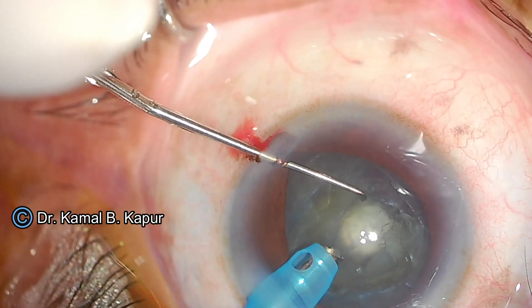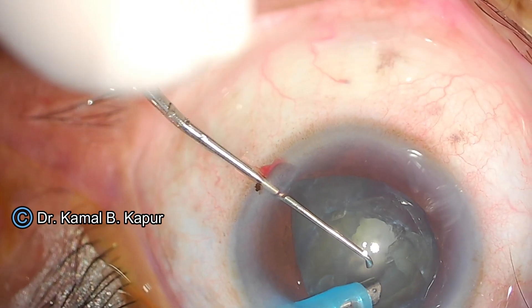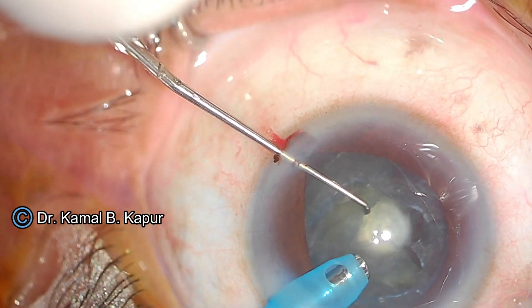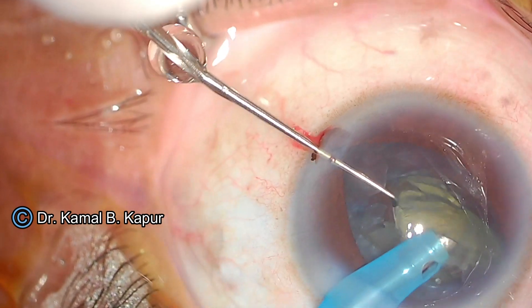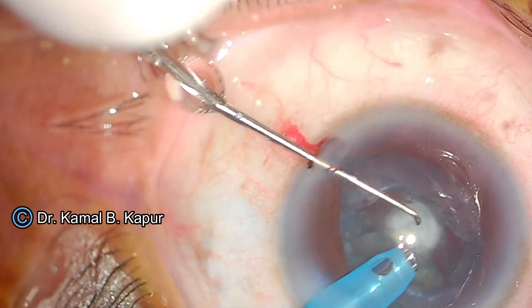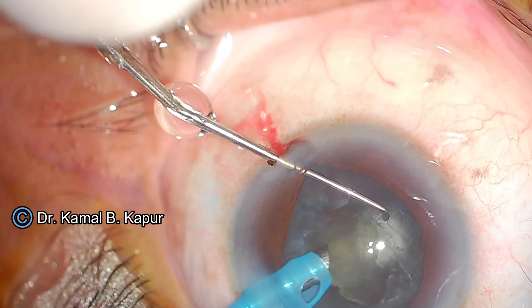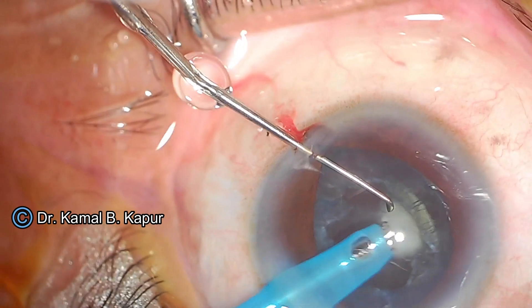This has ensured that I have debulked the nucleus, created space into the bag, and now rotating the phaco tip in another direction gives me enough space to break another piece of the D segment. These two half pieces of each D segment have been broken, which creates enough space in the bag for me to lift out the rest of the D segment — done in a very controlled manner. Now we have a cortical plate and an epinuclear plate stuck at the back, with most of the nucleus removed.